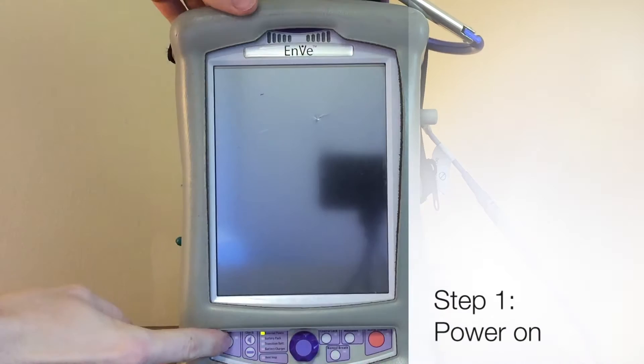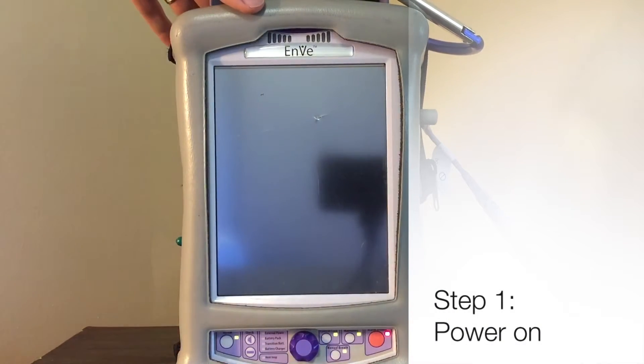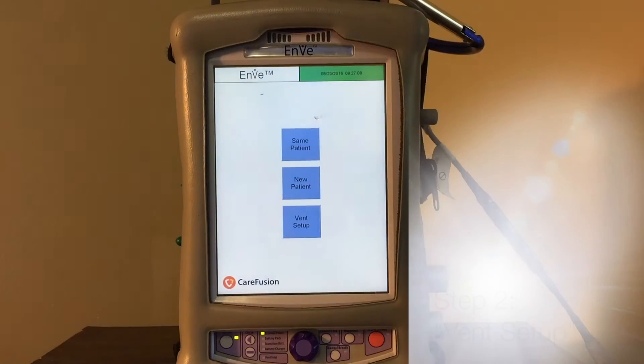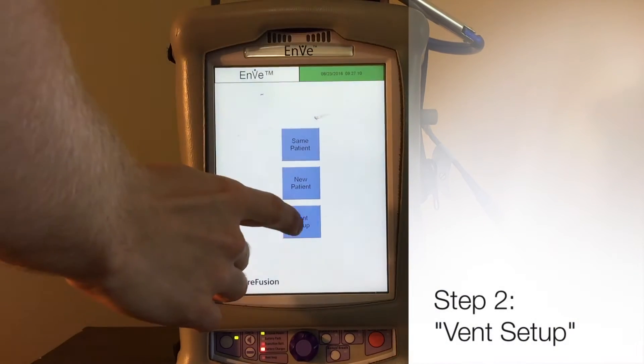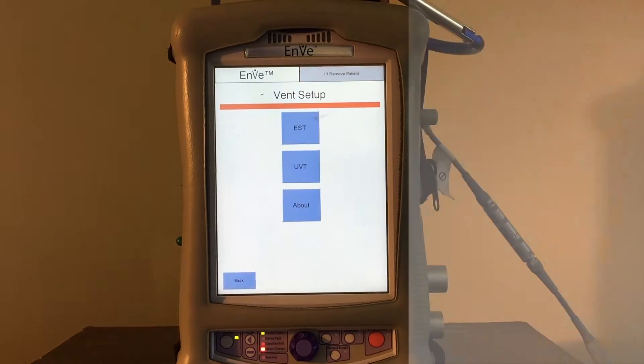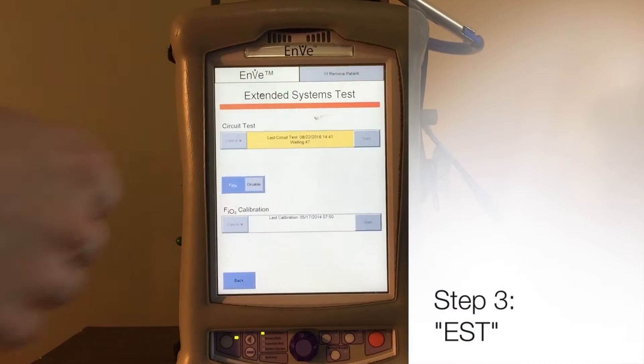The very first step is hit the power button on the bottom left-hand side. Once it powers up, you're going to be shown a few options and you're going to go all the way to the bottom and click Vent Setup. You'll be taken to another screen and at the very top you'll see there it says EST. Go ahead and click that.